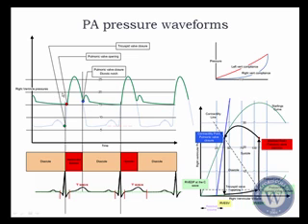That indicates that this waveform, which is the actual stroke volume generated, is to a certain degree affected by this pressure volume curve over here. So the overall health of the heart will tell you how well this emptying is taking place. If you have a limited stroke volume, this waveform will become smaller, just as you would expect under pressure volume curves.